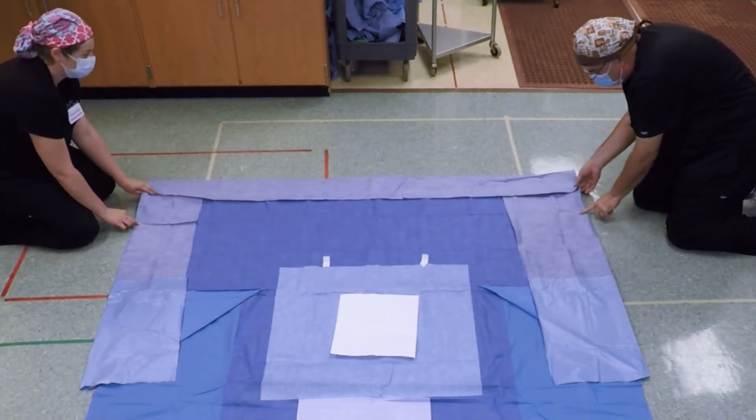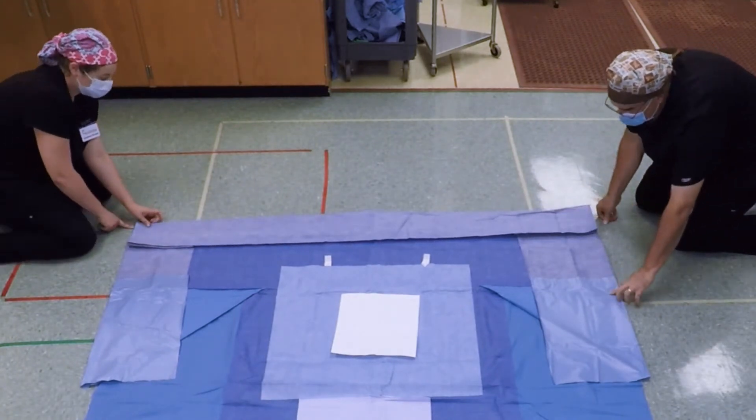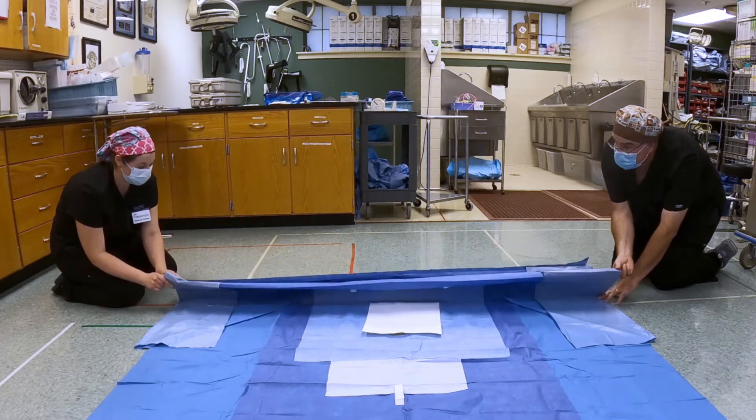This one comes up — put your finger here, flip it up, and bring it in. This one, the crease is way down here; find this piece, bring it up, and bring it in.